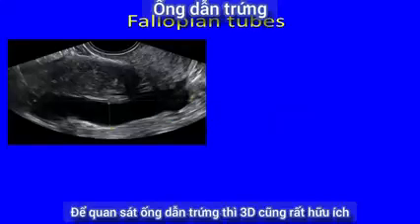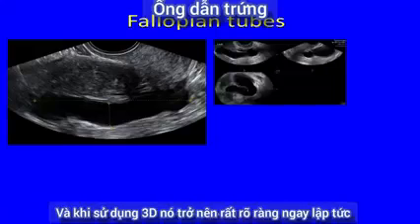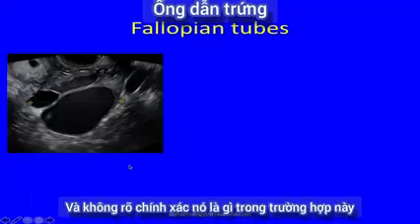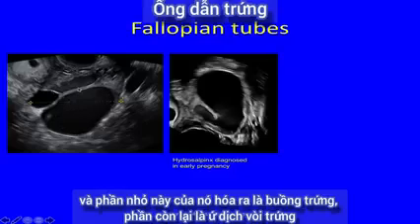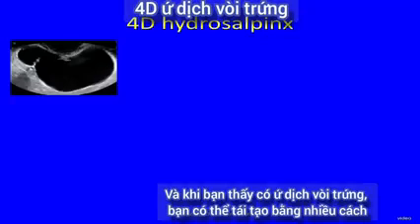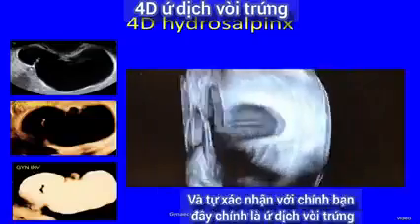Looking at the fallopian tubes, 3D is very useful again. In this view I've got a longitudinal view of the uterus and there was a pocket of fluid just behind — whether that was free fluid, loculated fluid, or maybe a hydrosalpinx. Taking a volume made it instantly obvious that it was, in fact, a hydrosalpinx. In another case, an adnexal mass just lateral to the uterus wasn't clear exactly what it was, but on 3D it was a hydrosalpinx, with only a small part turning out to be ovary. Sometimes if people have had PID, the tube becomes very fibrotic and thickened — this is what that would look like on 3D. When you see a hydrosalpinx you can render it in different ways, or take a video clip to look inside and confirm it is indeed a hydrosalpinx.